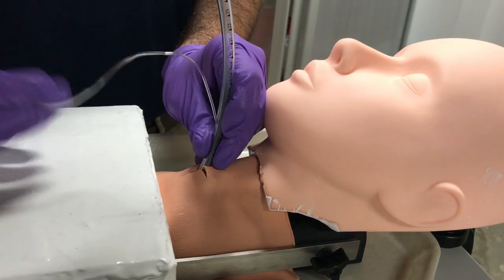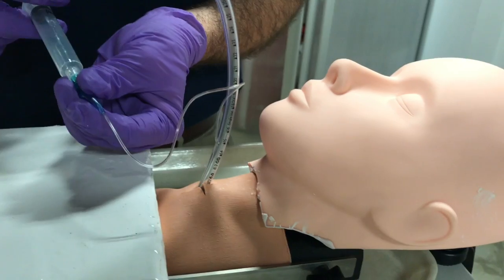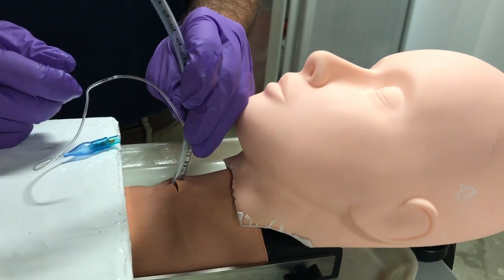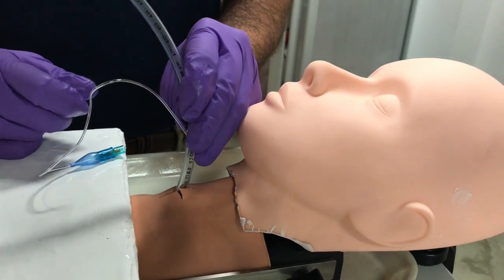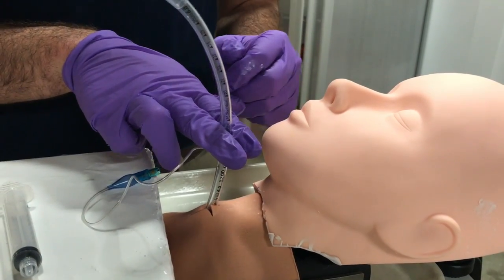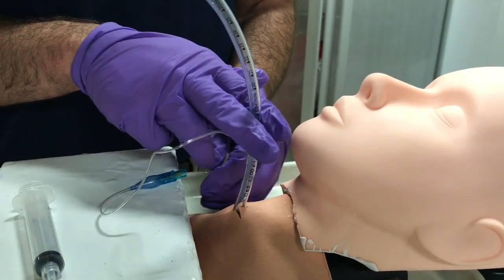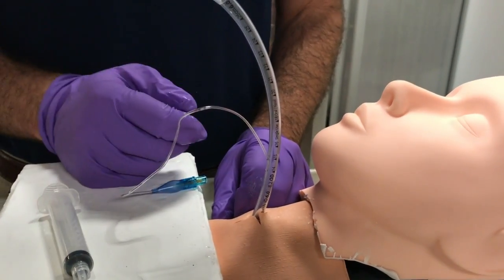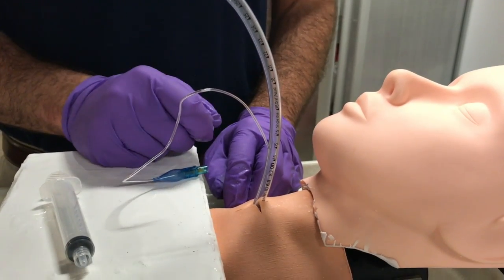Once your endotracheal tube is in the airway, inflate the cuff. Verify tube insertion into the airway using your bag valve mask, looking for color change, and listening for breath sounds, making sure you're not too deep. You can then cut the ET tube just above the balloon inflation apparatus and trim the tube so it's not sticking out as far. Finally, when the clinical situation allows, contact ENT for urgent revision to a tracheostomy.